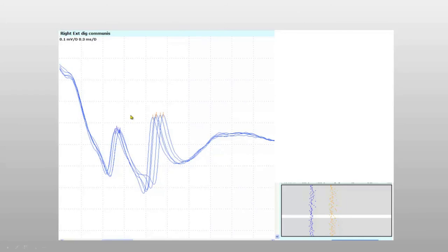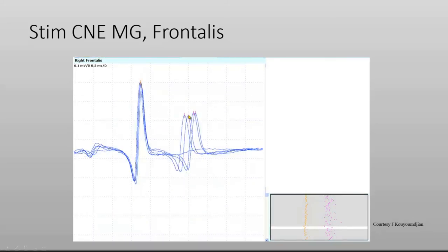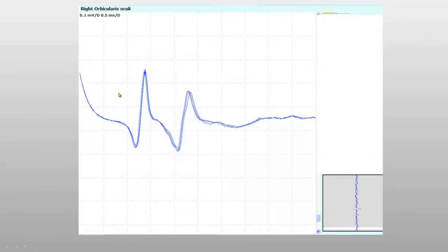In a patient with myasthenia, one motor end plate was normal and another was abnormal. The jittering signal shows clearly increased variability, and on superimposition we also see missing impulses. We checked by increasing the stimulus — the second signal never came back, so it is biological, not technical: it is due to myasthenic blocking. In a situation where the second signal shows an inflection above 50% of the amplitude, we have two jitter values. Those recordings are omitted and the electrode is moved slightly so one fiber dominates.